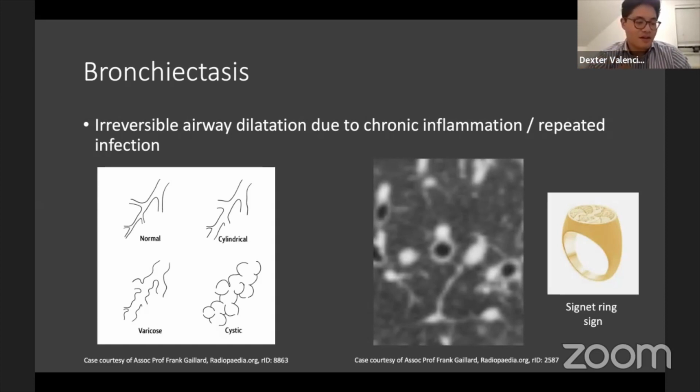I apologize for that. How useful is CT in radiolucent ingested foreign particles, peanut, almond, in a patient with signs of breathlessness? So again, yeah, CT is very useful because it will help you find where the foreign body is. So I hope that answers your question.